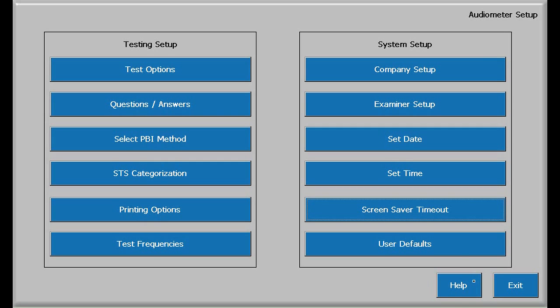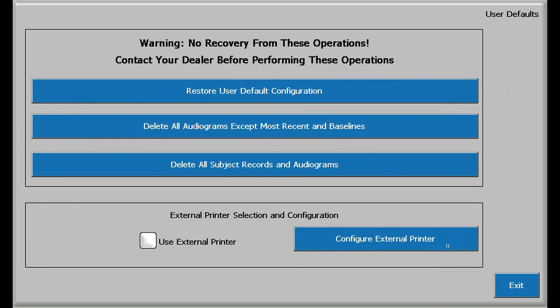The final configuration, user defaults, allows the user to restore the audiogram to a previous configuration as defined by your Tremetrics representative, and to batch delete audiograms from your RA800. The external configuration is the subject for future videos. Let's press exit to leave this screen.